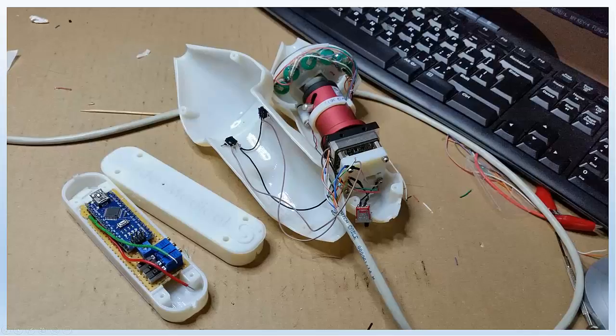So finally, I can give you some examples. This is the prototype. This is the electronic controller I built, and you can see here the light source. Here is where the lesion is supposed to be situated, and another polarizer that blocks the superficial information and allows the underneath information to go to the camera. And from here, the computer is doing the rest of the job to understand underneath distortions.